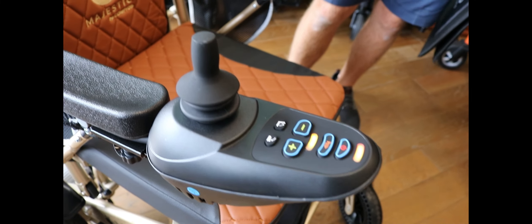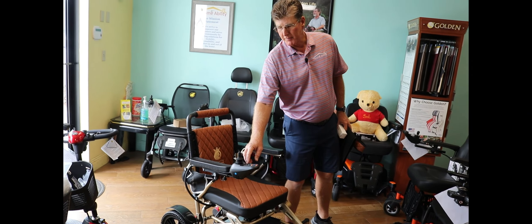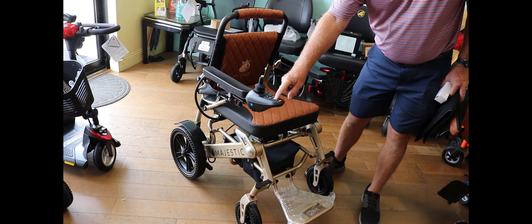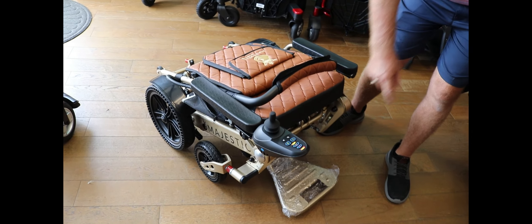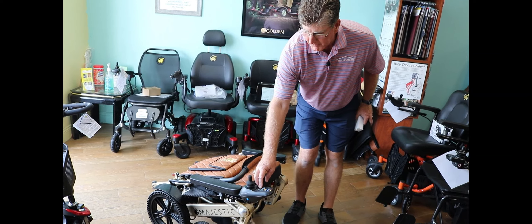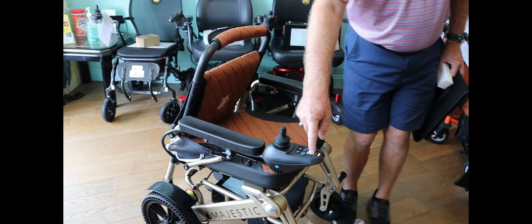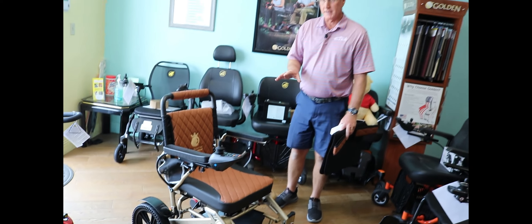Here's one of the neat differences — this is actually an auto-fold power wheelchair. Watch what happens: if I'm putting this in the vehicle and I want to fold it up, one button and it folds up. When I want to get it out of the vehicle and open it up, two buttons and it's open.